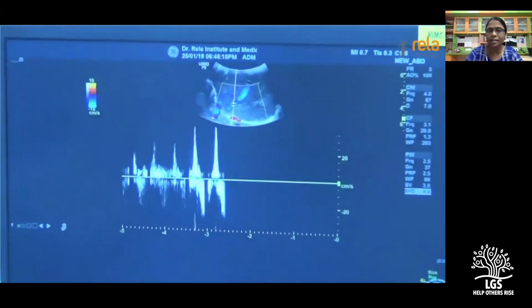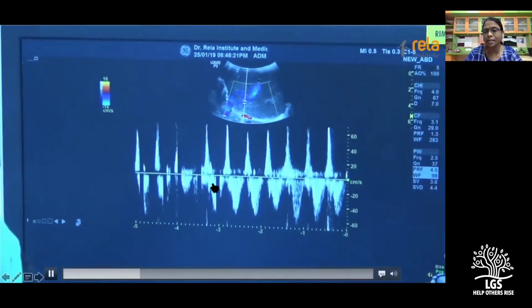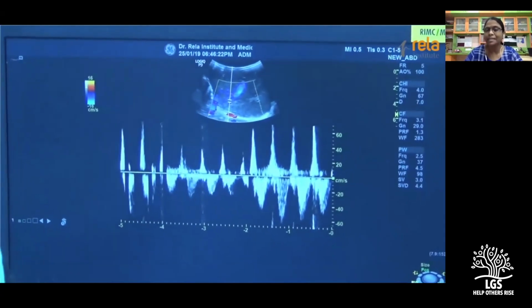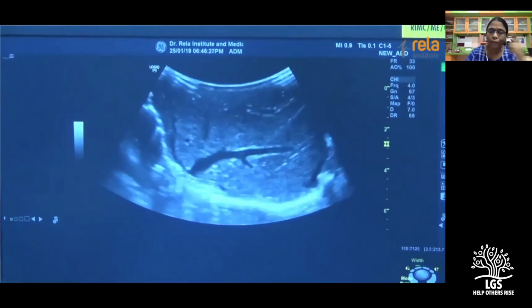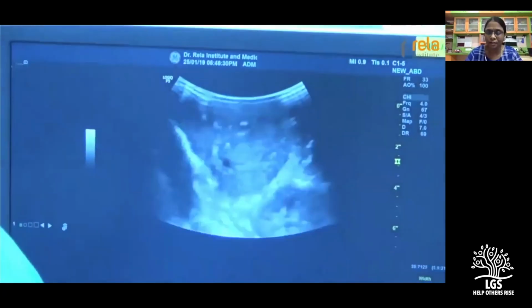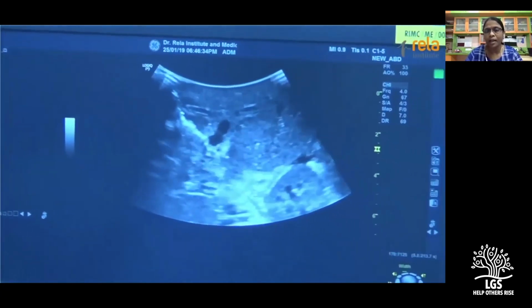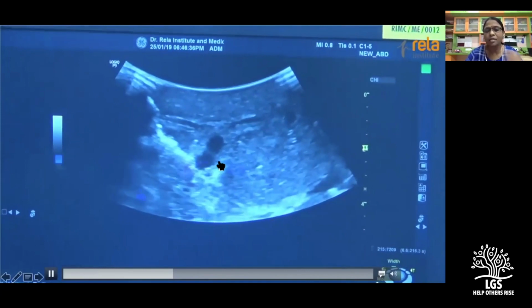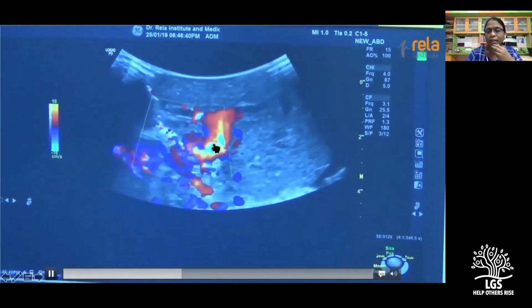Cranially, we can see the hepatic vein. The hepatic vein should be blue in color, and we should get a classical triphasic pattern of the hepatic vein. And whenever a V5, V8 reconstruction is done, we should also image V5, V8 and the IRHV. And this is how we image the portal vein at the Rex recess. The portal vein has to be imaged.